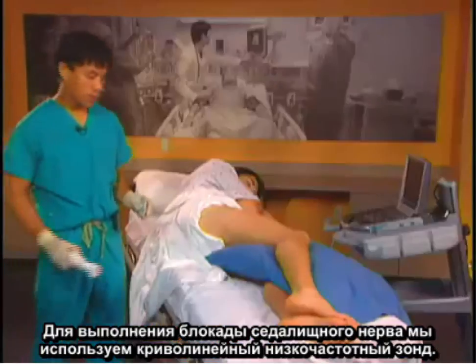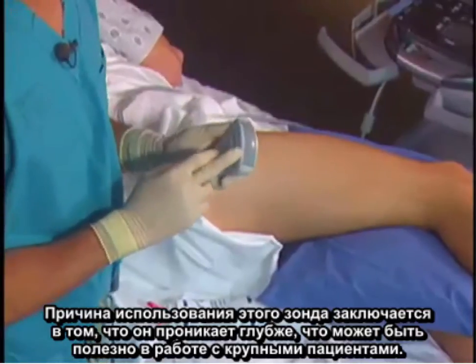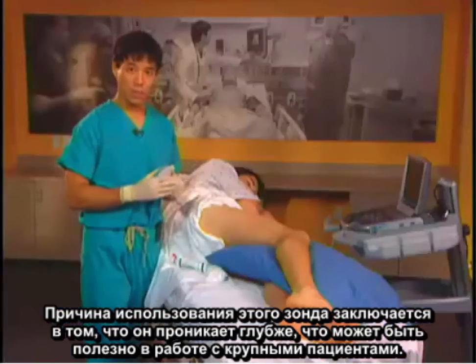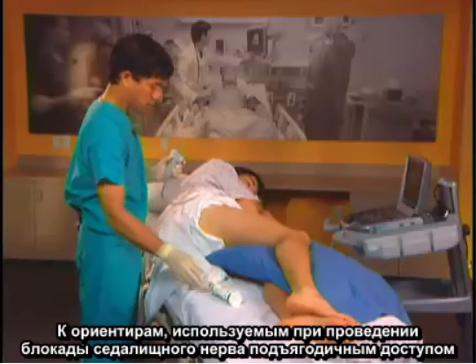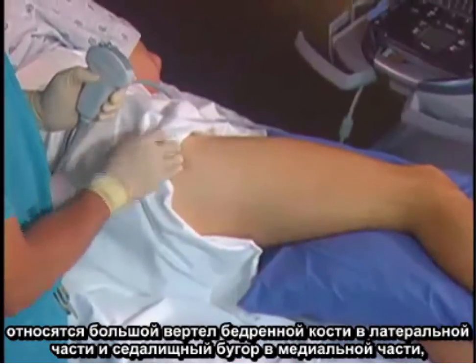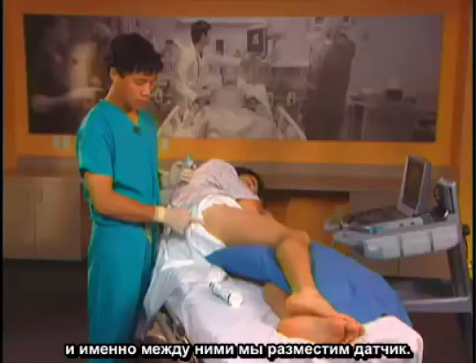The probe we use for a sciatic nerve block is a curvilinear low frequency probe. The reason we use this probe is because it penetrates deeper, and this is useful in larger patients. So some of the landmarks we use for the subgluteal sciatic nerve block are the greater trochanter laterally, the ischial tuberosity medially, and directly in between these two is where we place the probe.